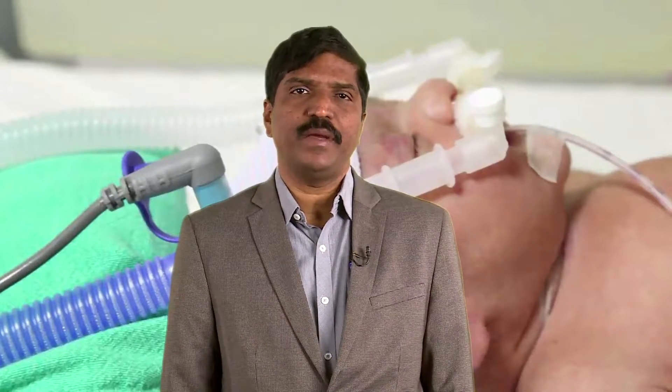Prevention of snubbing is needed to prevent pressure sores and skin injuries. Nasal and nasal septal injury is preventable by careful observation using correct prong size, appropriate prong fixation, and appropriate attachment of prongs to cap and CPAP tubings.